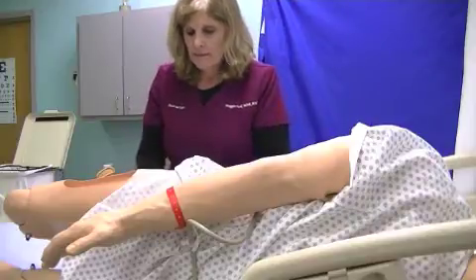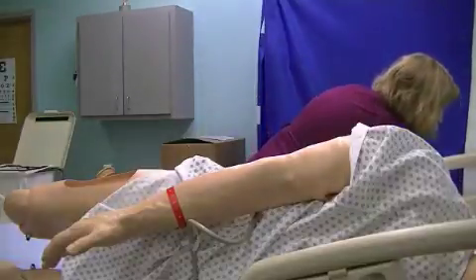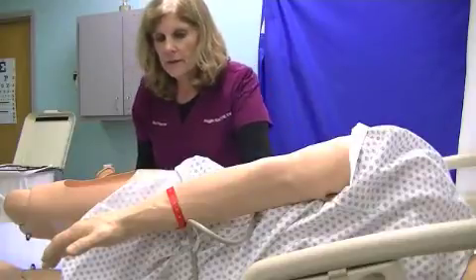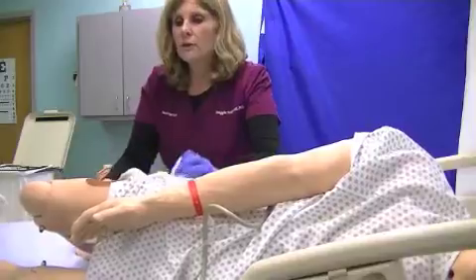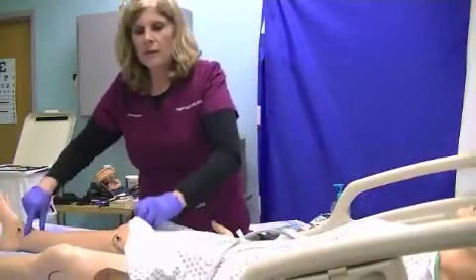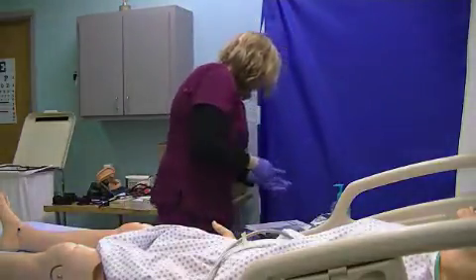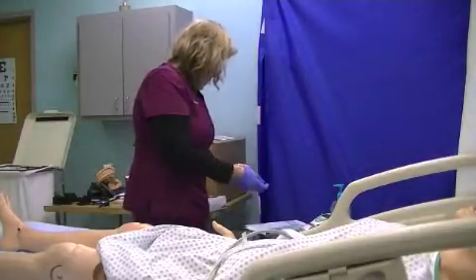When it's done, you're going to, of course, push the sheath off into the trash can, put the thermometer back, and wipe off the rectal area. During this whole time, of course, you would have the curtain pulled, especially because you're doing a rectal temperature, and you would try not to expose the patient for very long. And then I'm going to take off my gloves and wash my hands.